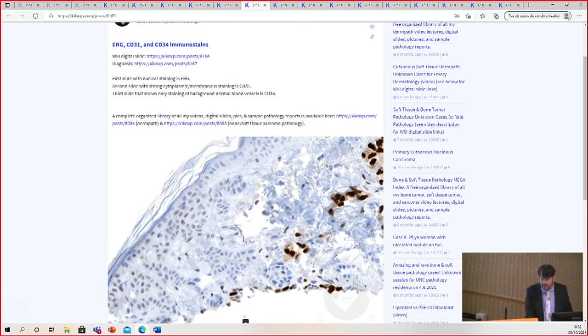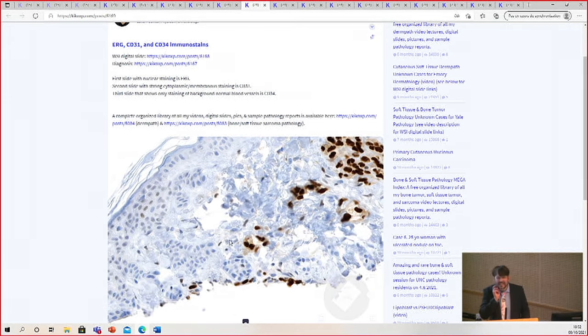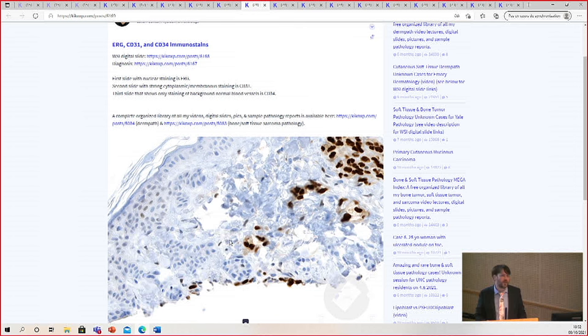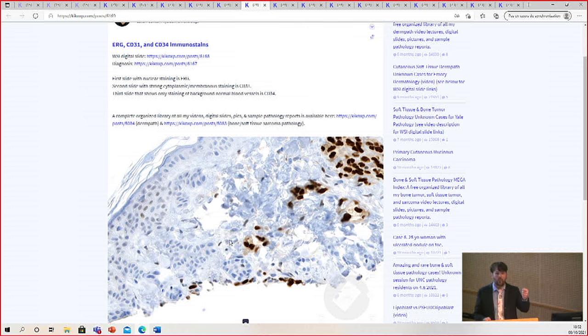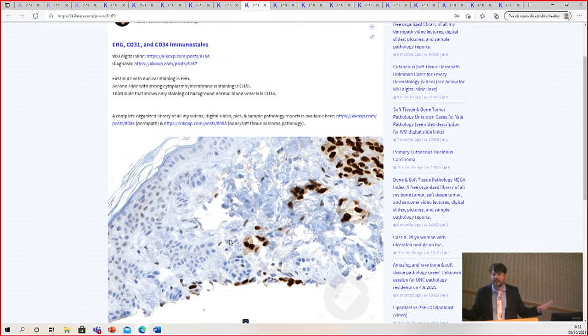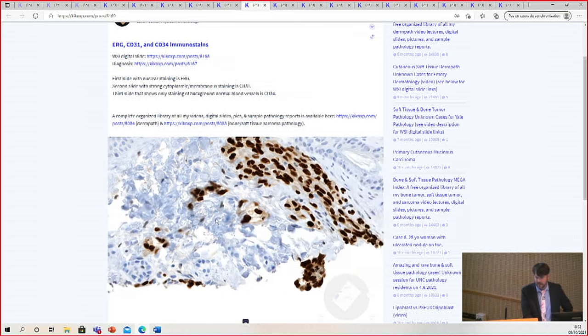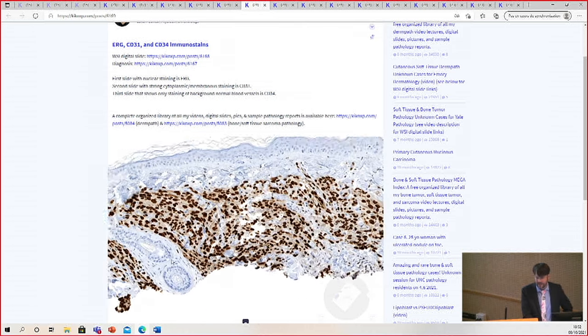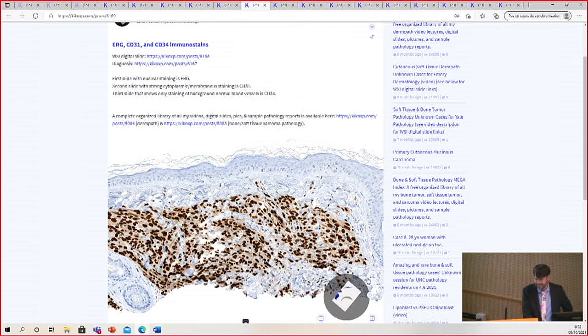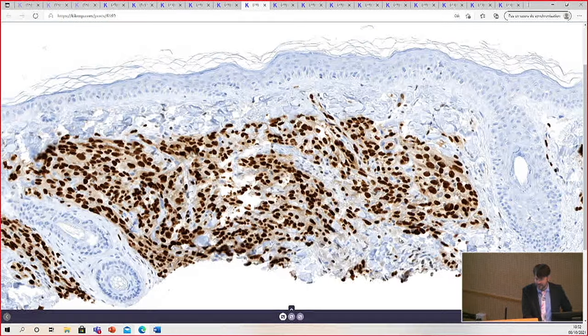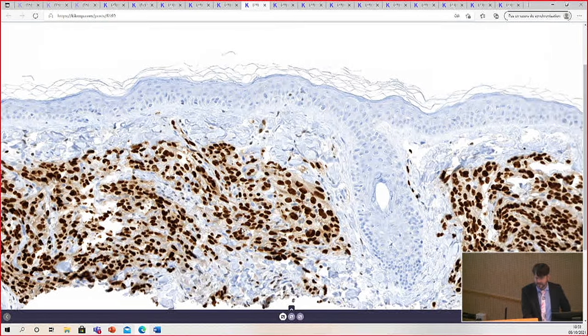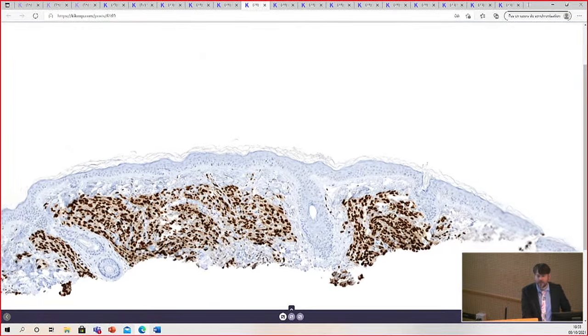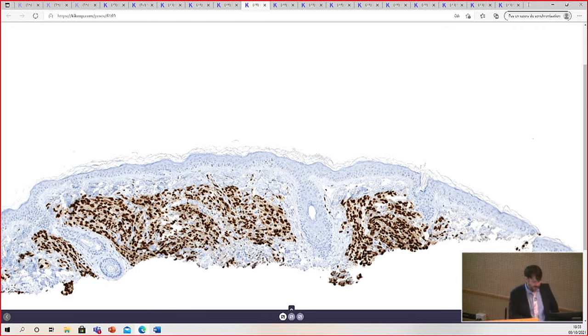And if you have to ask, is this enough ERG? The answer is probably no. When you have an angiosarcoma, you put down the ERG or the CD31 and you're like, whoa. You're not like, well, it's a little focal. No, let it go. That's nothing. It will be blazing, knock your socks off, as we say in America. Like that, right? Good enough to be the control tissue.